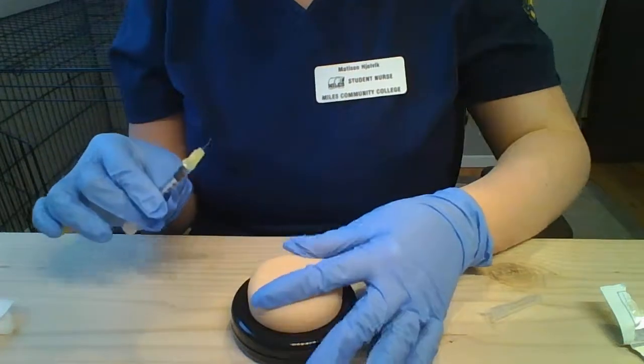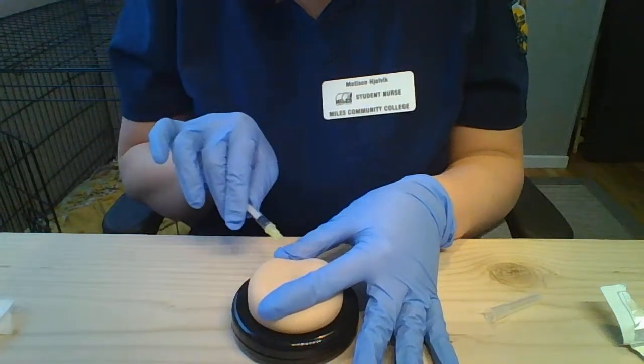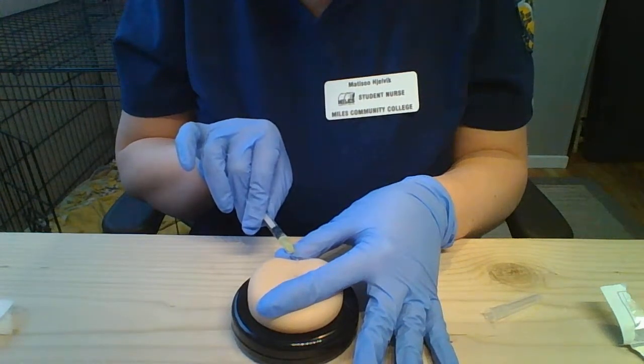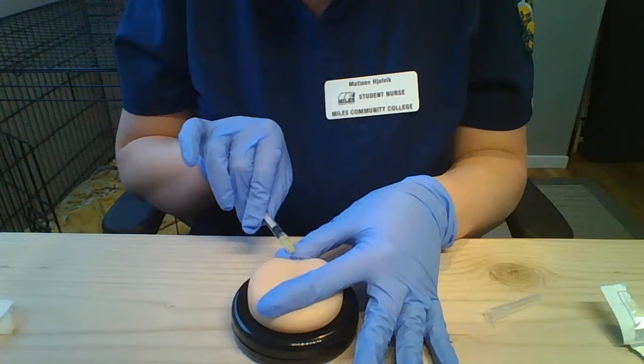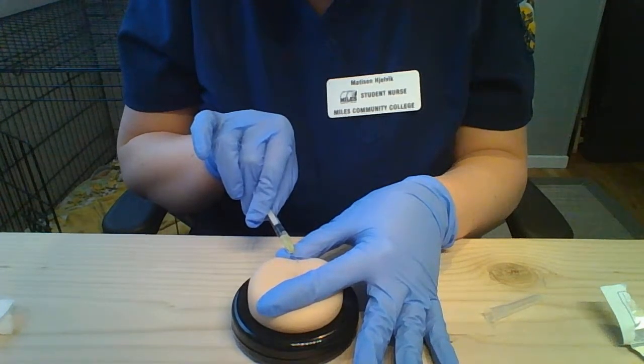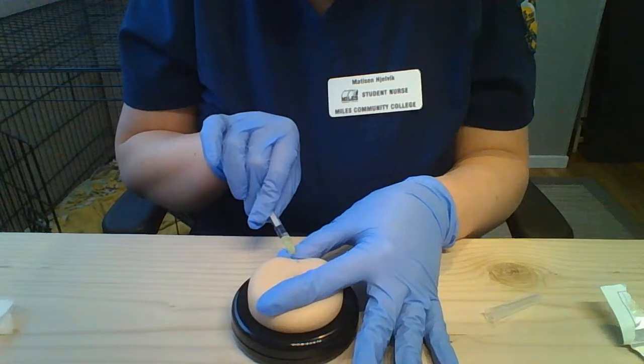So then with my non-dominant hand, I'm going to stretch the skin out and insert the needle at about a 5 to 15 degree angle, only about 1/8 of the needle into the patient's skin, with the bevel pointed upwards.